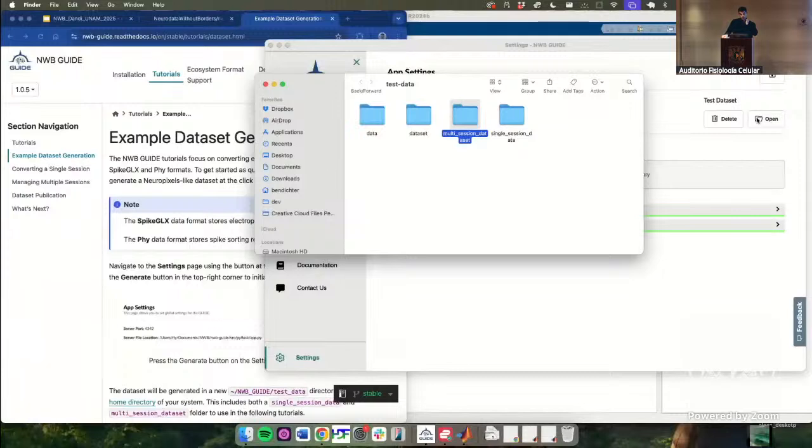This new chip, what's called OpenEphys? Is this part of it? It's also supported, yeah. With Neuropixels, you can either record in SpikeGLX format, or you can record with the OpenEphys system into their custom binary format, and we support conversion of both. We just see this format more often. That's why we included it. But the other one is equally supported.